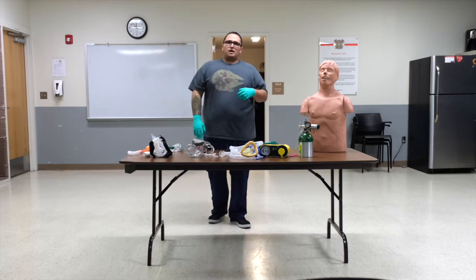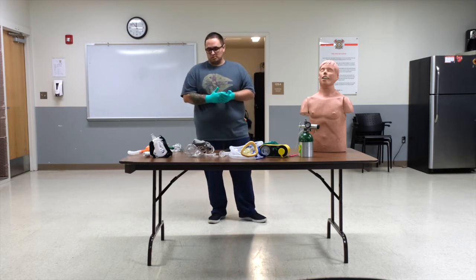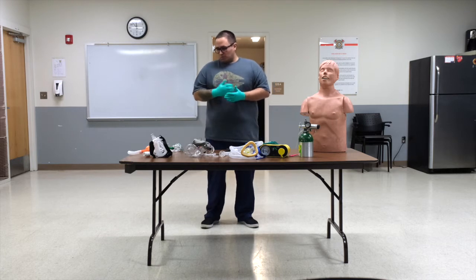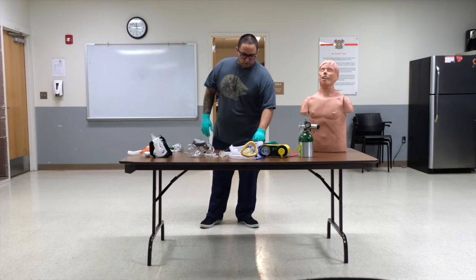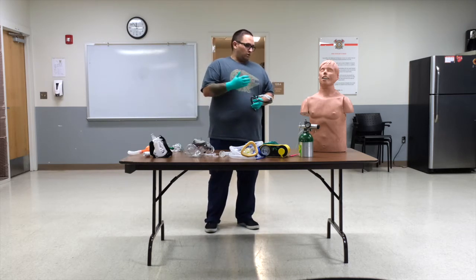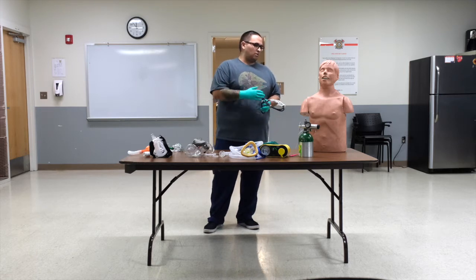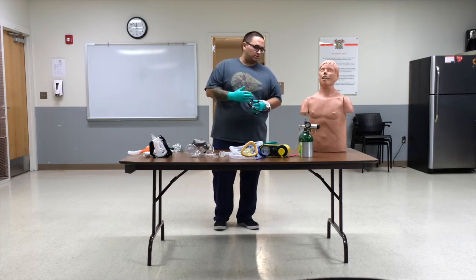So when we do CPAP, we're doing this for patients that often have respiratory distress, pulmonary edema, fluid built up in the lungs, and in some cases reactive airway, depending on your system. It tends to work pretty well for what we need to use it for. So first things first, we need to assess our patients. We need to have our PPE on. We need to greet our patient. We need to assess their level of consciousness and their respiratory status as well.